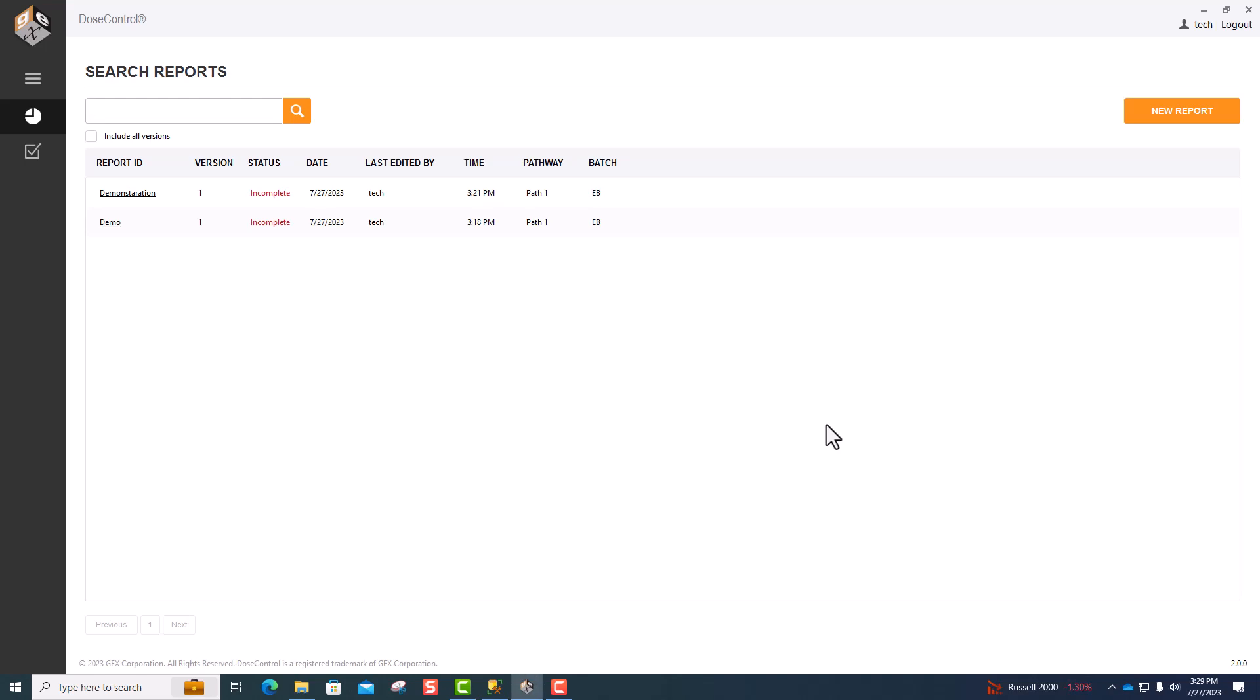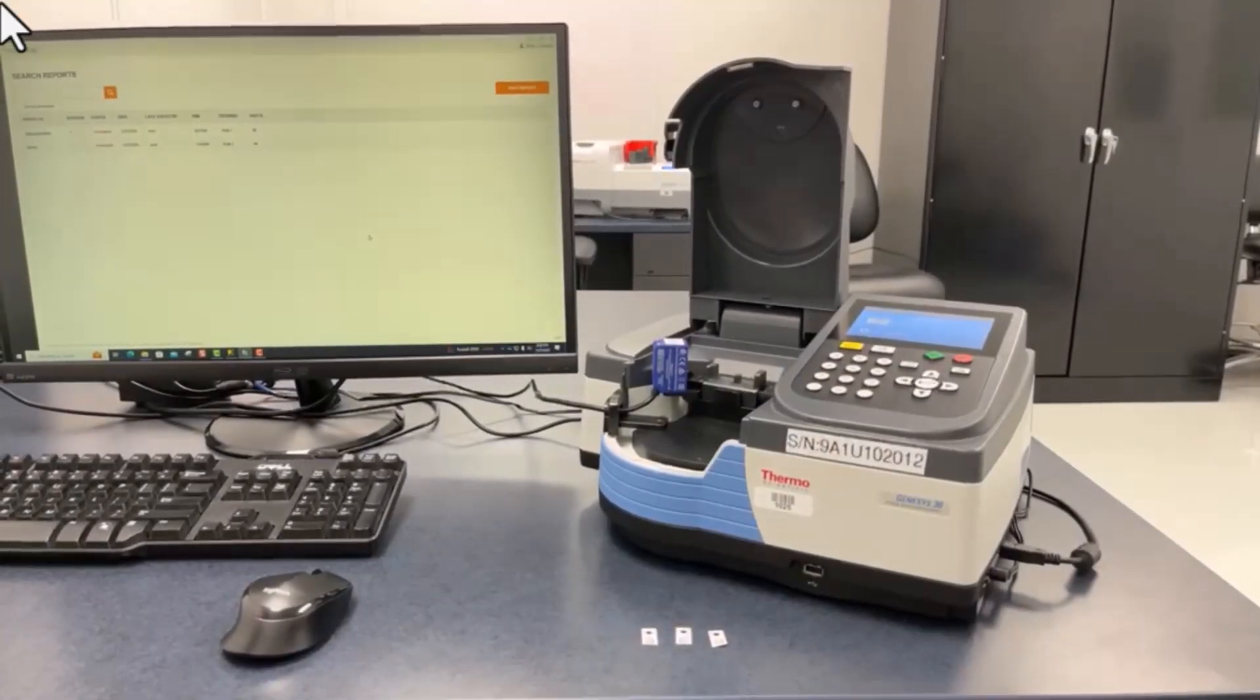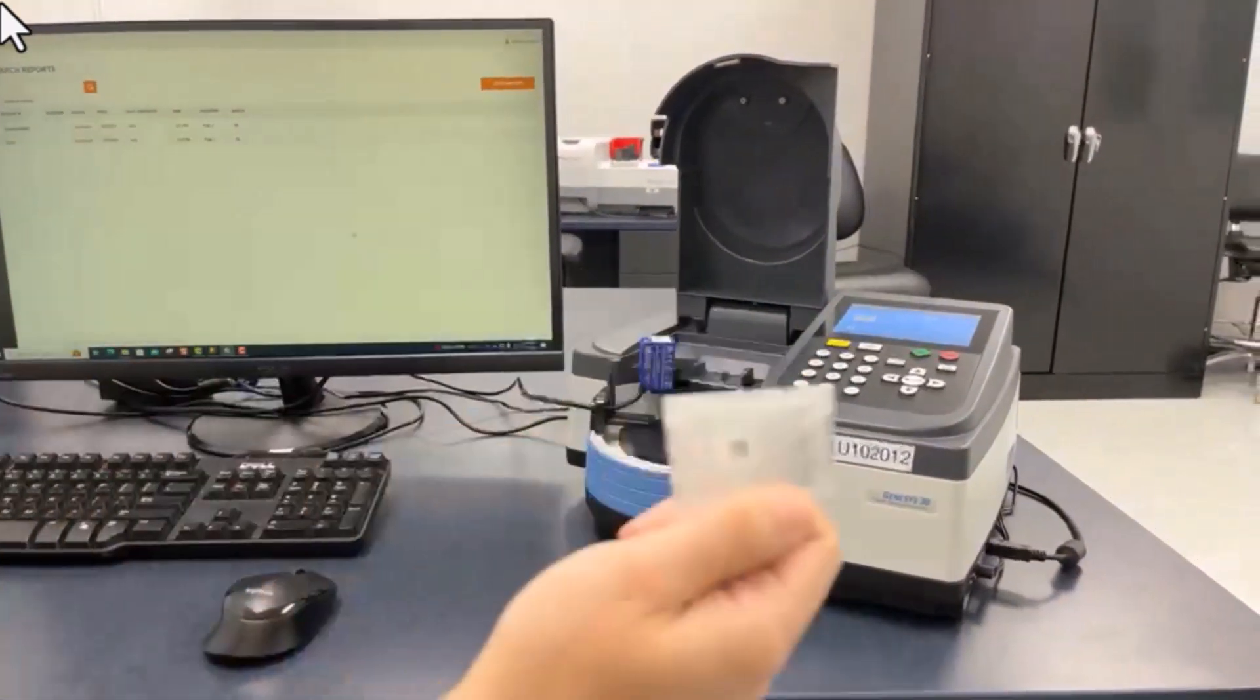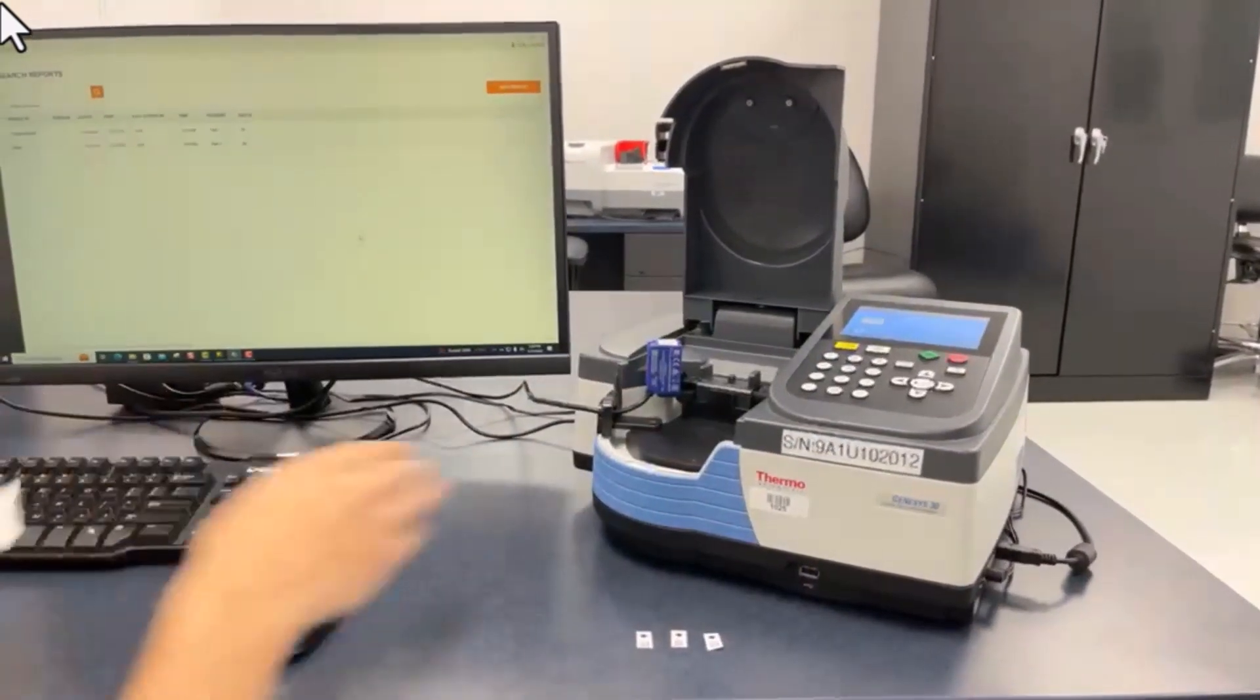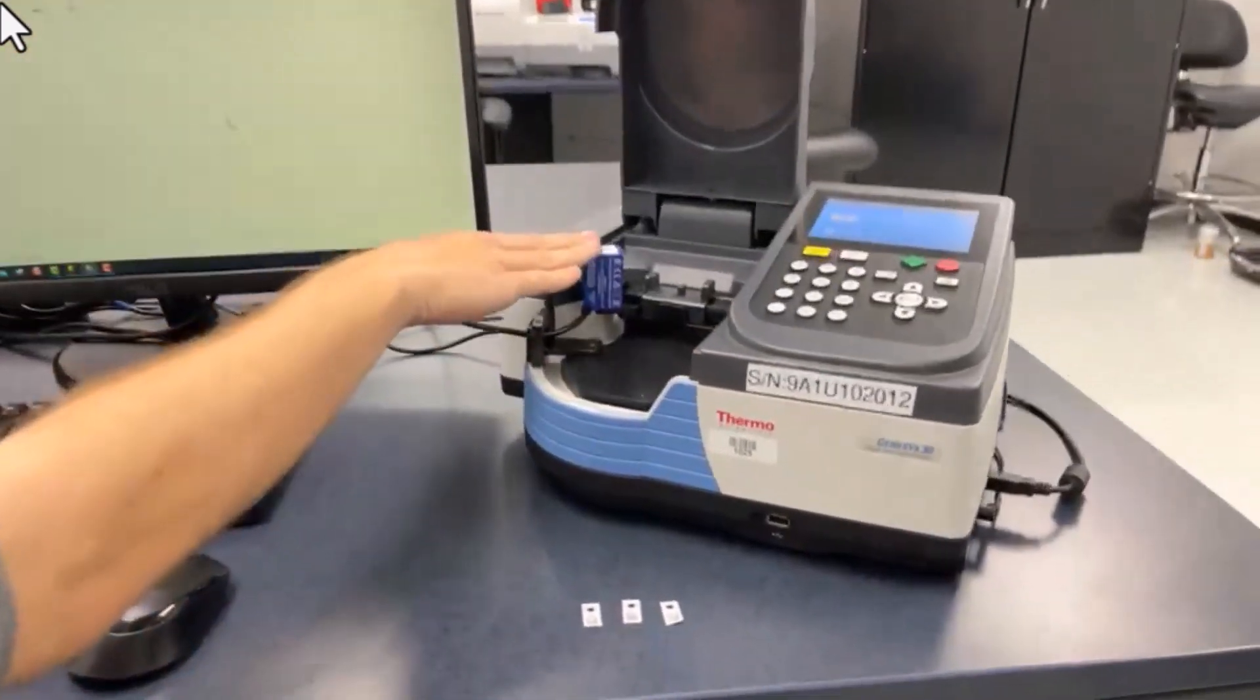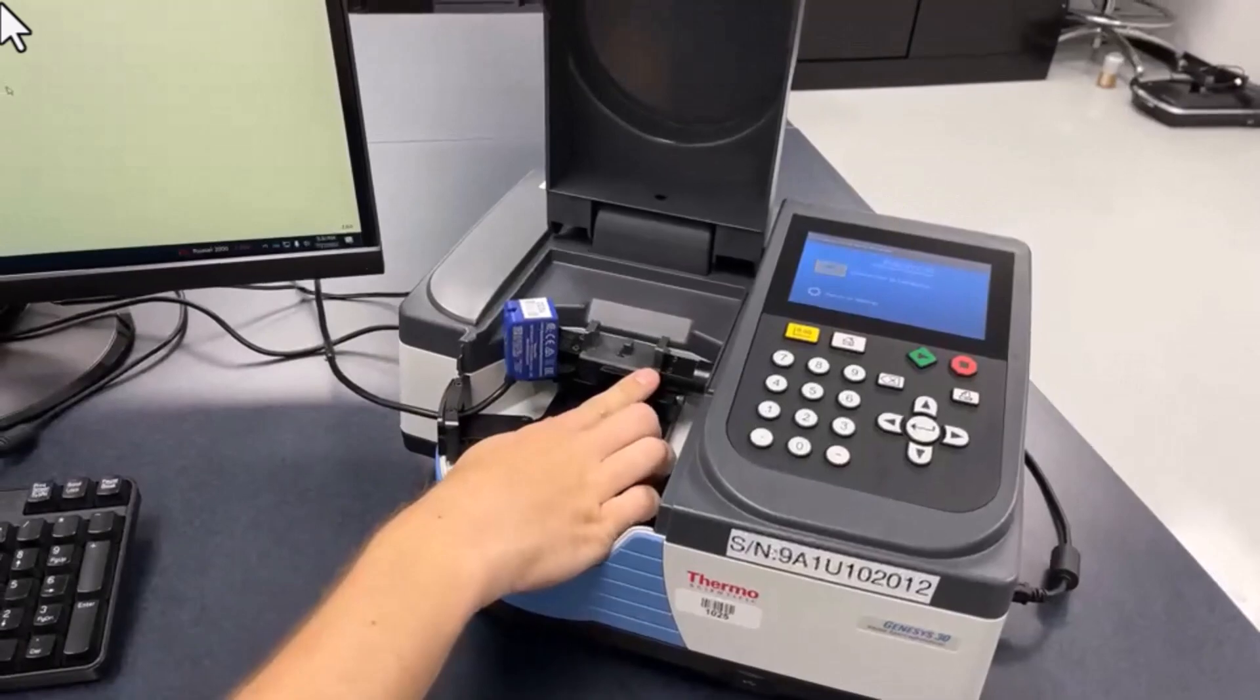Hello. Today we'll be going over how to measure the new GEX-GB3 dosimeter using the Genesis 30 spectrophotometer with an installed matrix barcode scanner and an installed GEX-GB3 dosimeter holder.